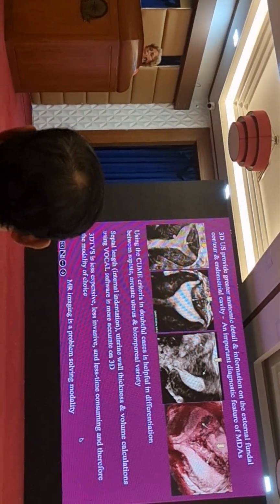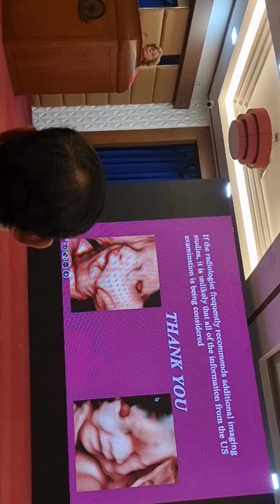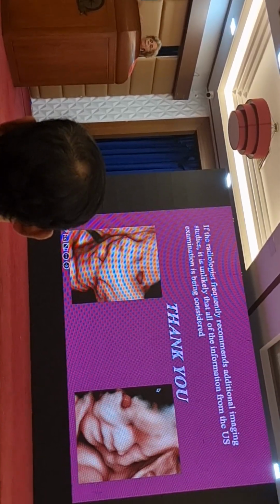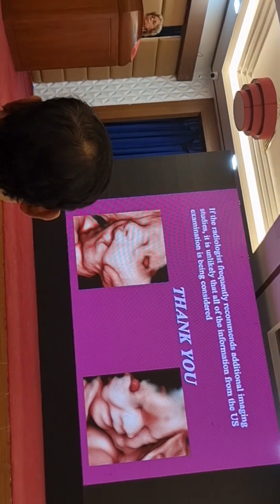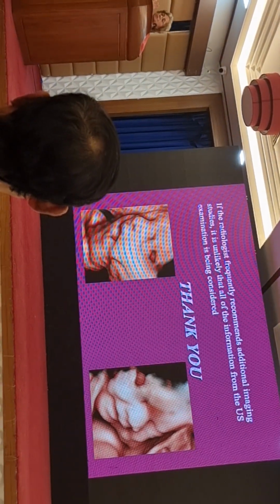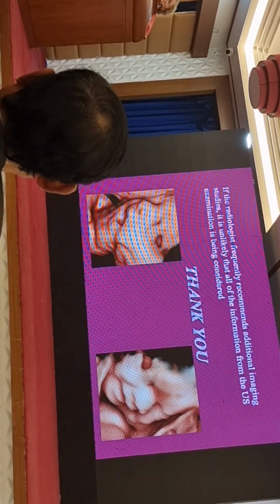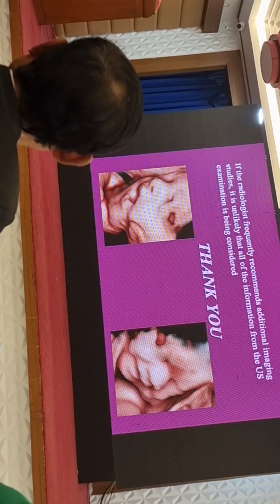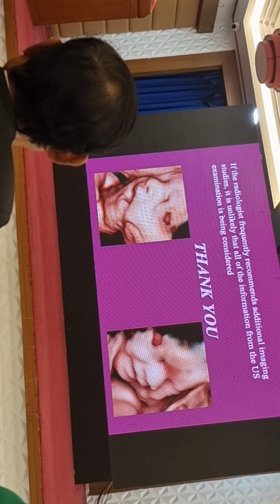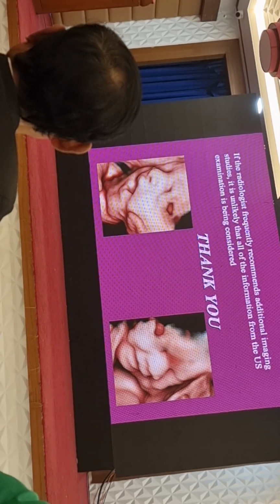MR is a problem solving modality. But I would like to add one thing here. I have had patients who come with an MR, and then it's very difficult. One such patient where MRI was reported as complete septate, I could not find it. I called up my friend, I called up two radiologists to come to the clinic, and I said, you have to come here and look, I cannot send this image. And they all said it was a normal uterus. So I don't know MR, so I can't really say how it went so wrong.